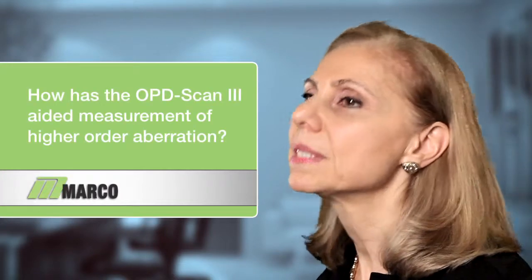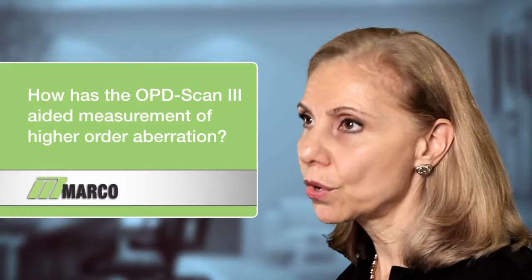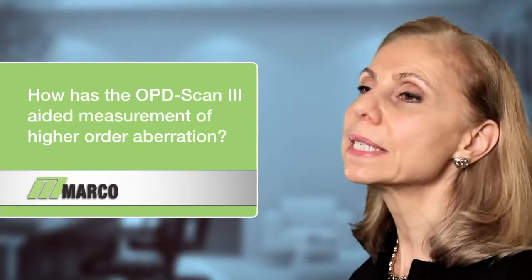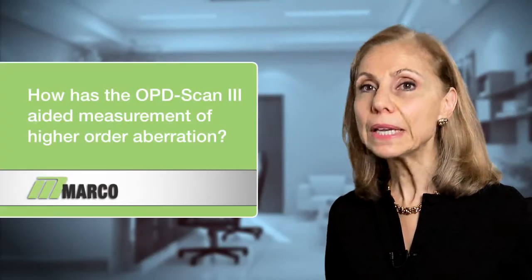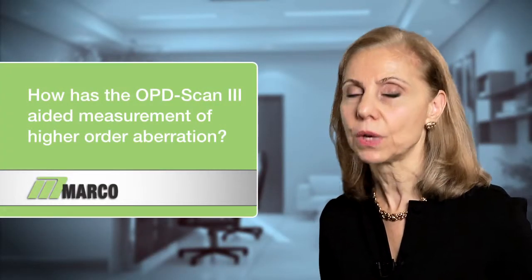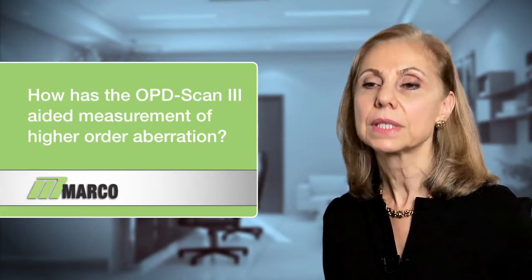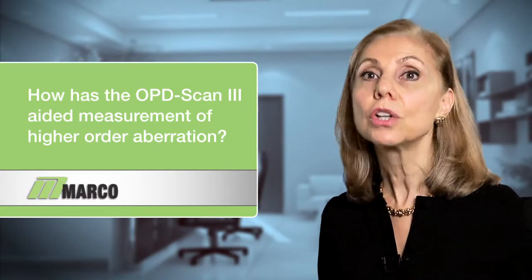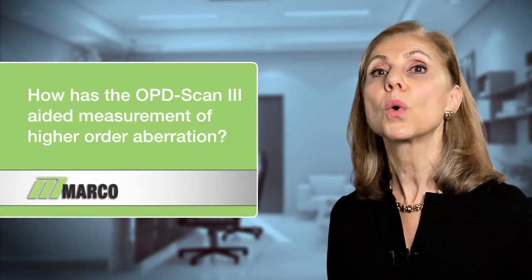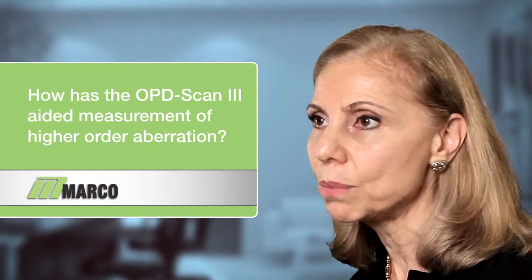One of the maps that's available on the OPD3 is the higher order aberrations, which we can display to the patients through point spread function, pre and post cataract surgery. And I use this with every one of my cataract patients. I'm able to show them exactly what their vision looks like looking at a source of light with their cataract in place, what that point source of light will look like after their cataract has been removed.